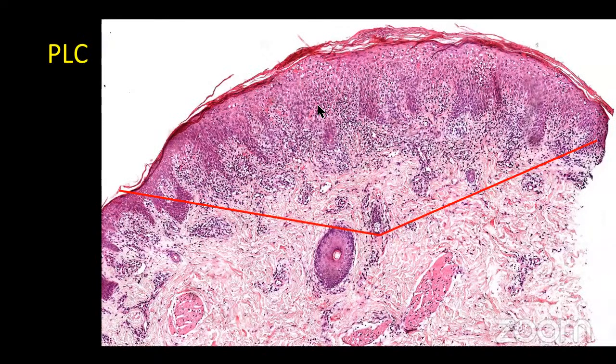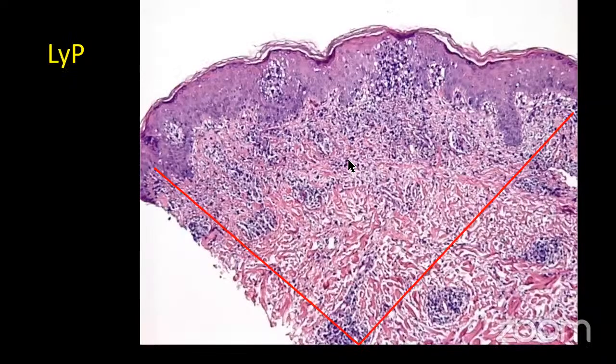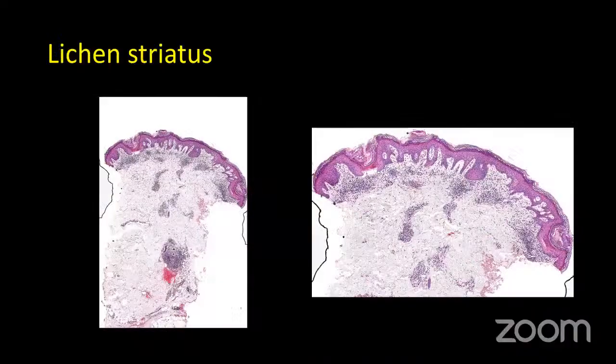Just to drive the point home, here you've got your scale crust. My clue when I was a resident and got these as an unknown was to see red blood cells trickling into the epidermis, but usually you can just see them in here. So that's another component. Lymphomatoid papulosis can also have a band-like and perivascular infiltrate and present as a wedge-shaped infiltrate similar to pityriasis lichenoides.